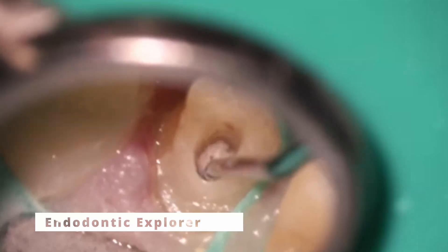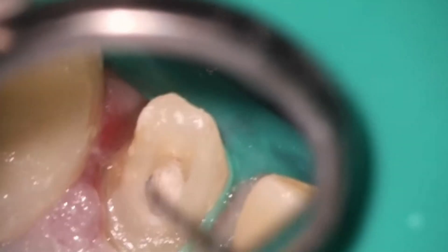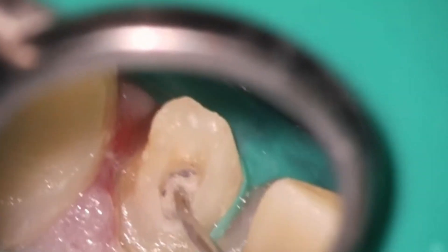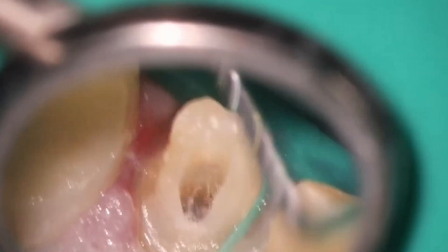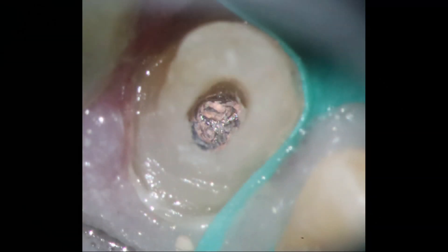It was a little bit difficult to remove. The crown was, I believe, already fabricated, so I tried to keep things as small as possible. However, I do have to get that post drill out of there, and a few other things you'll see in a second. I need to make a slightly larger hole than I would normally do. It was all composite. I still repaired it, but I try to keep it small, especially if the crown is already fabricated. You can see it's kind of a mess of post drill and gutta percha.